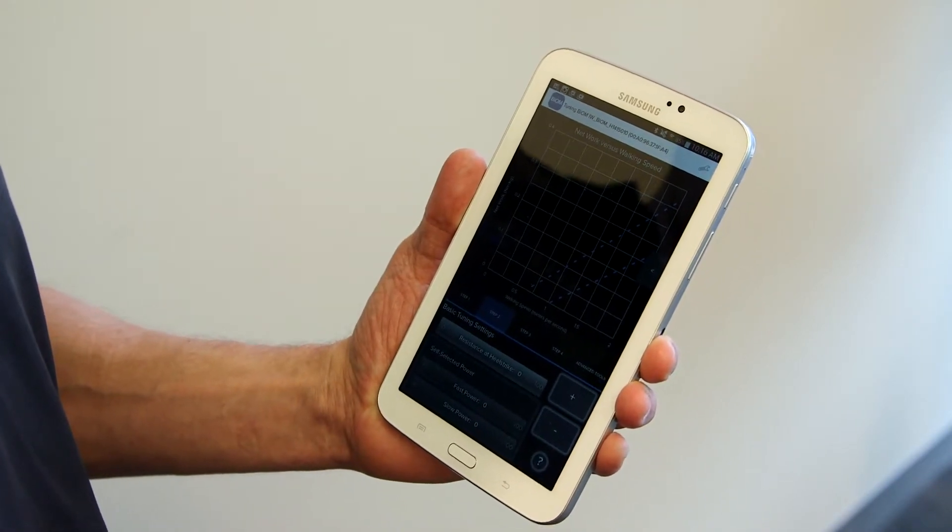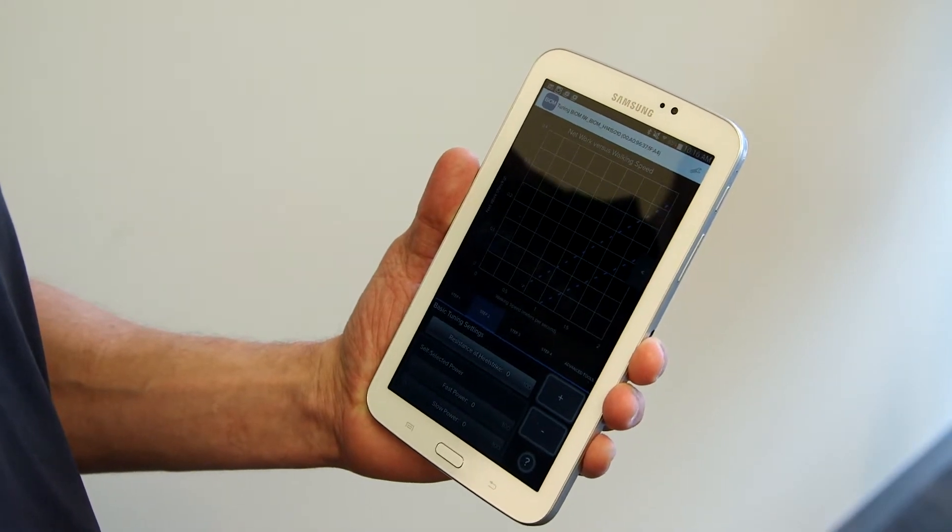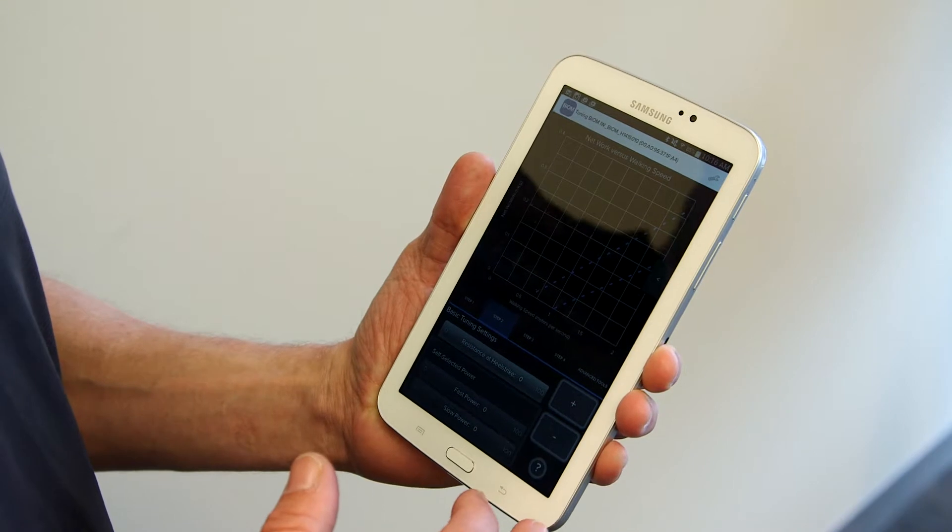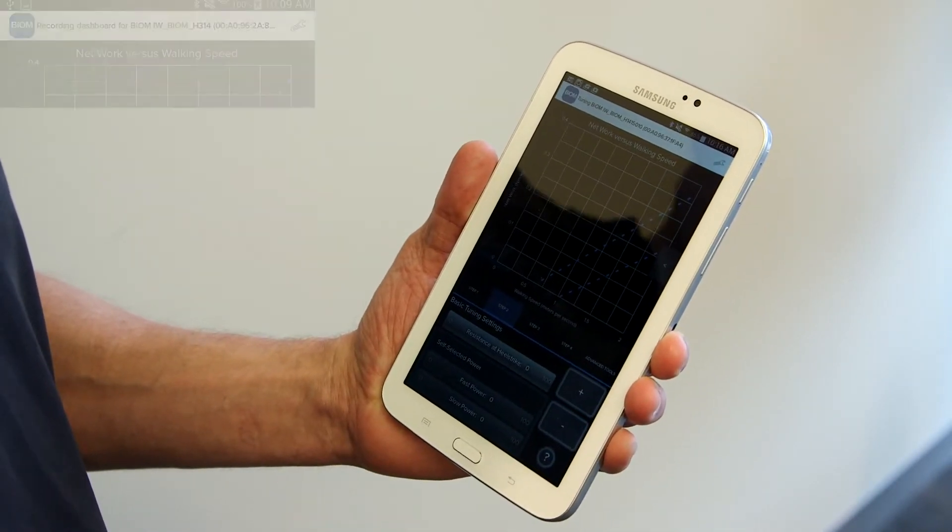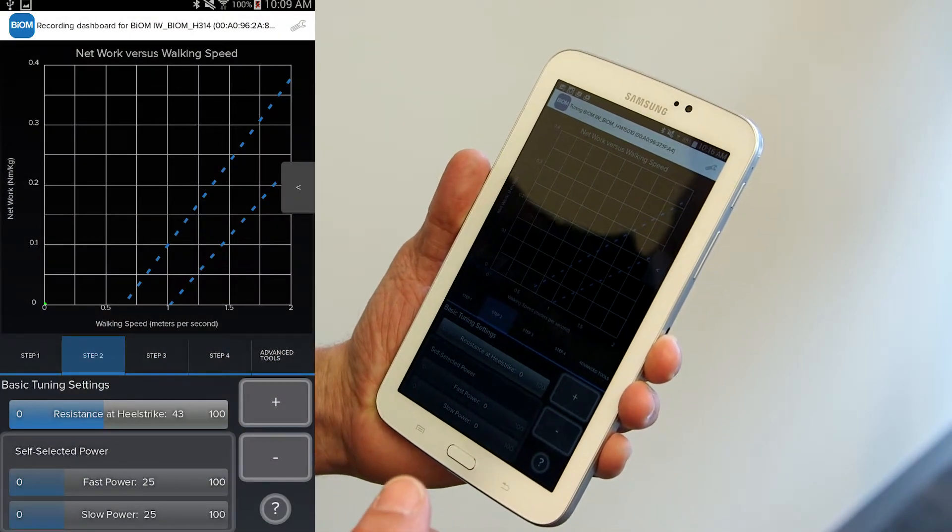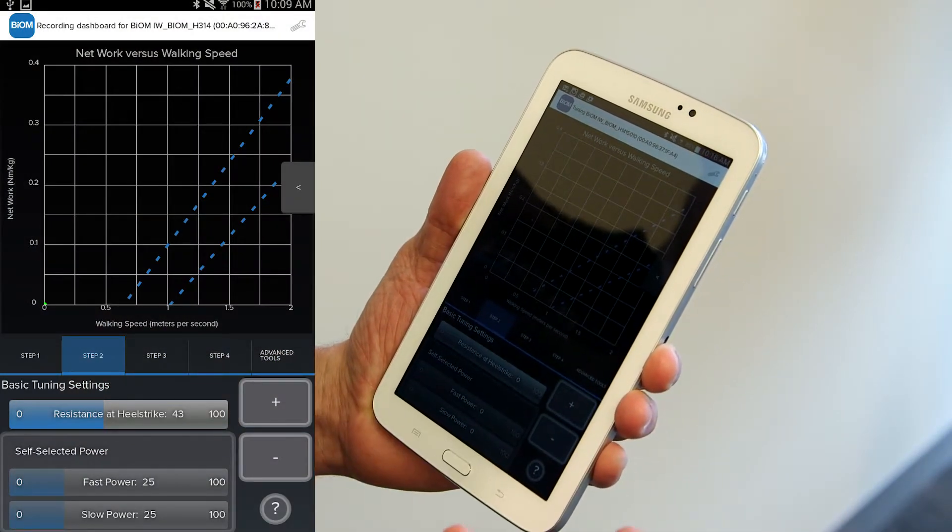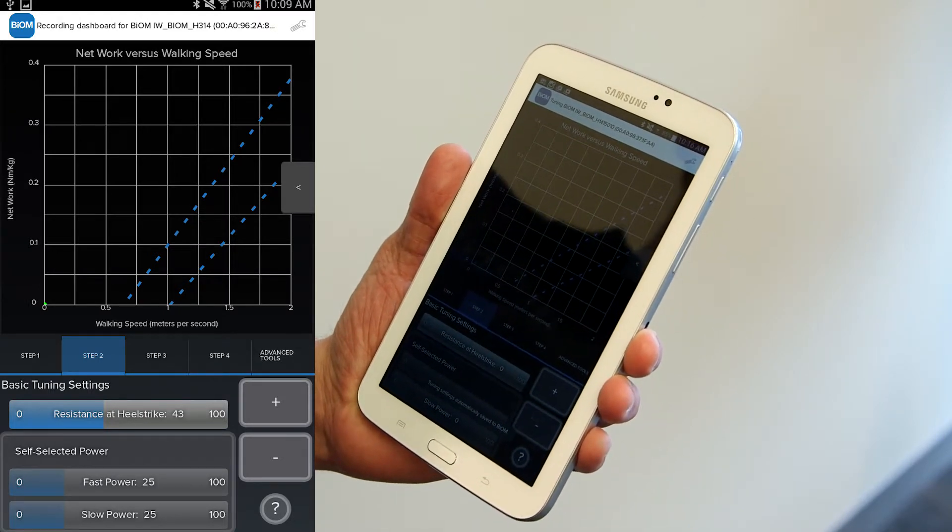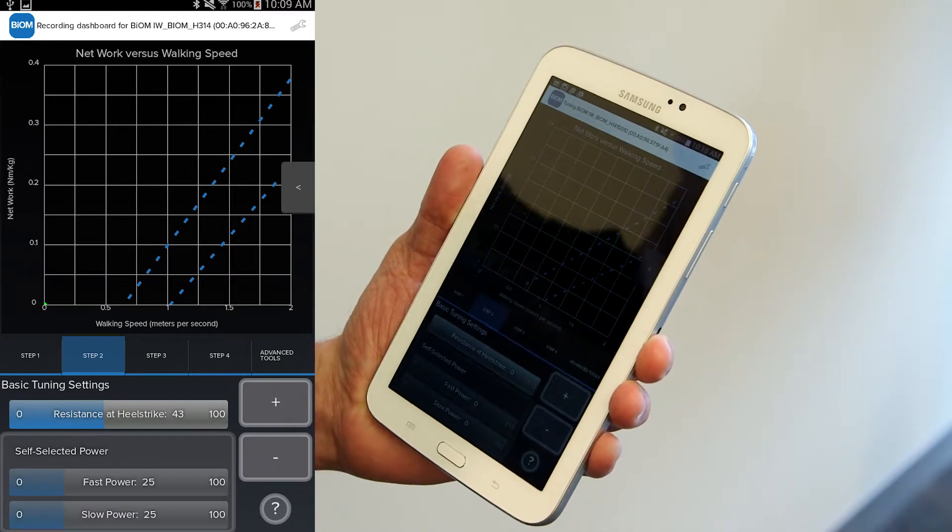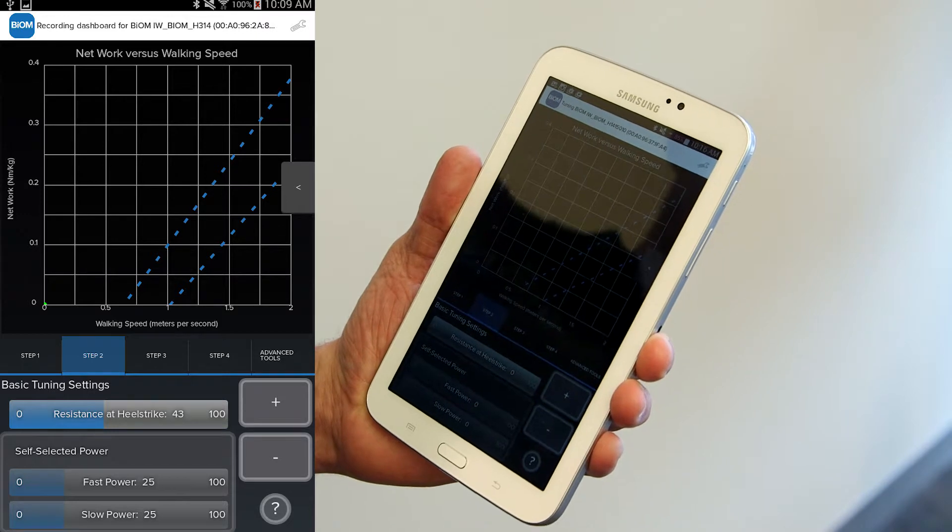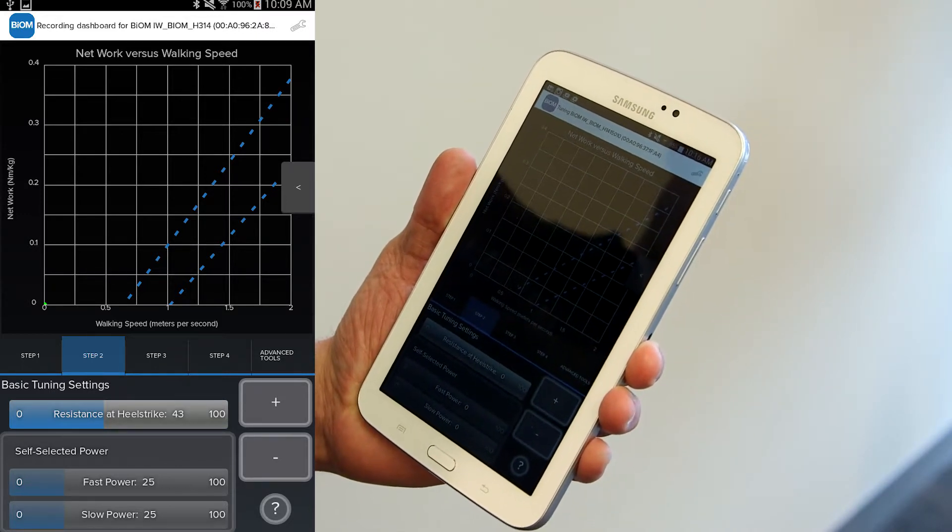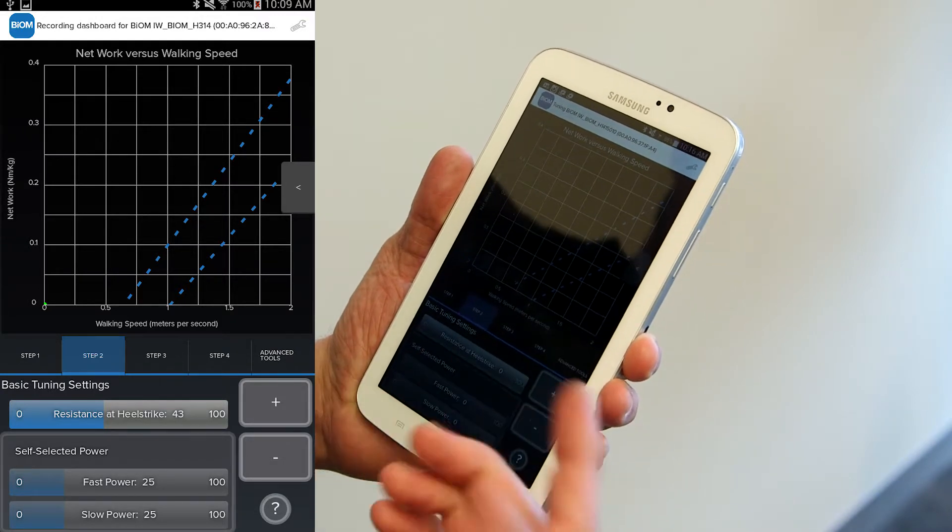After entering the patient's weight in step one, we move to step two. Step two is literally where you will do all the programming for the biome ankle. You'll see four parameters here, starting from top, working my way down. First is resistance at heel strike. If I choose this, this is going to represent how much resistance the patient gets from heel strike to foot flat. It's literally controlling the rate of plantar flexion from initial contact to when the foot strikes the floor.